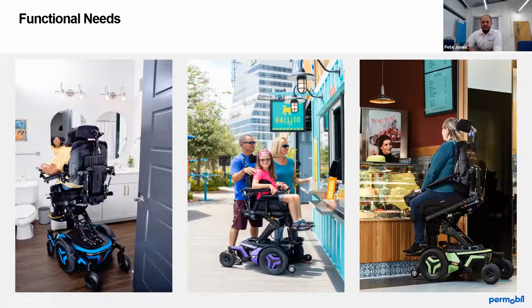And then using these power functions can lead to improved performance of activities of daily living, helping out with meal preparation, grooming, self-care, dressing, self-catheterization. This improved function leads to the users being able to do more things on their own and may reduce their need of caregiver assistance, which is important both from an integrity and a financial perspective.